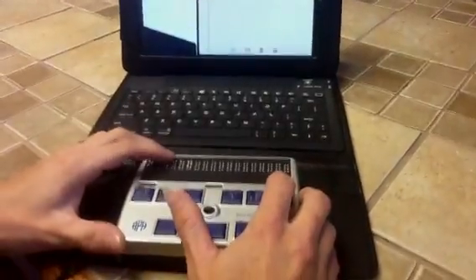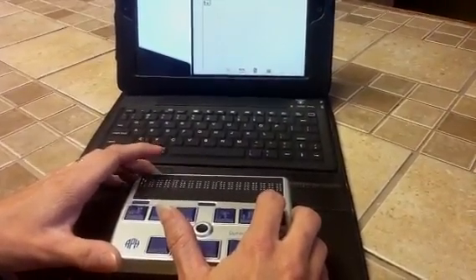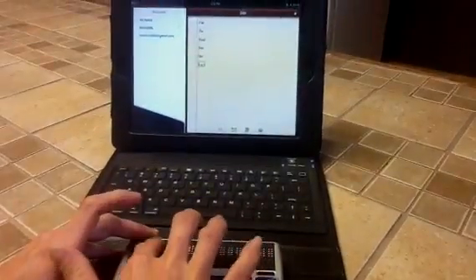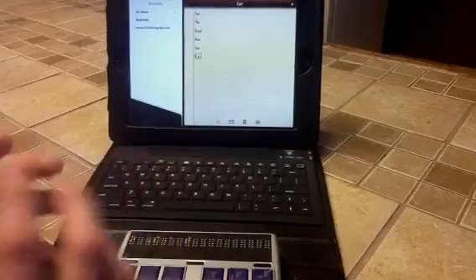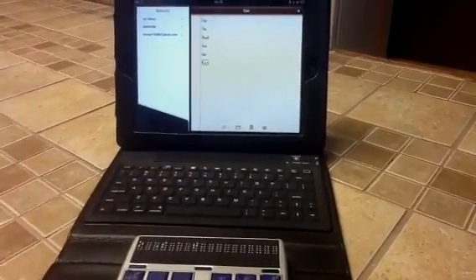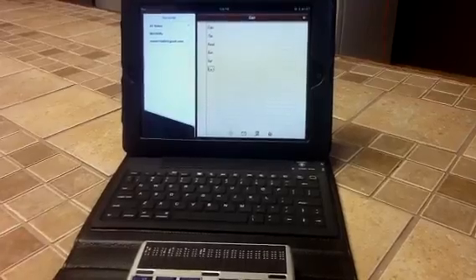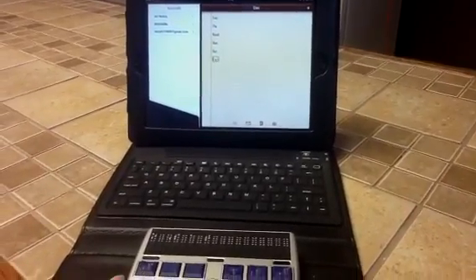And I'm going to move the cursor over here, and it'll say can. And then I can have it go S-A-T. Gives us a little more space for those beginning readers so that they're able to actually sound out the word and not be confused by too many contractions being together. Therefore, that's pretty much my demonstration for how you can create a document in print and have your student be able to read it in Braille using both the iPad2 and the Refreshabraille 18.